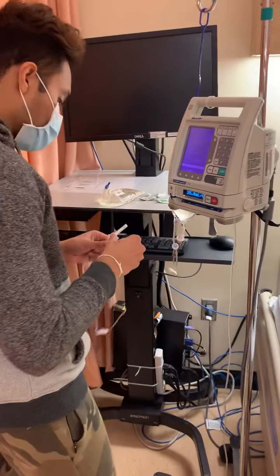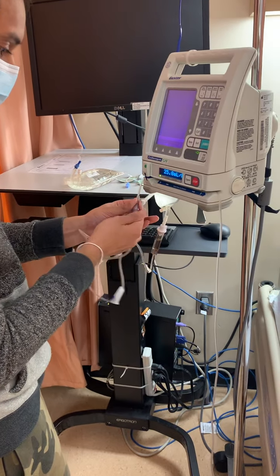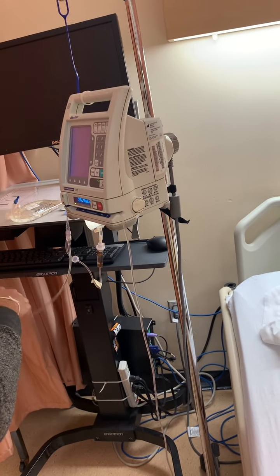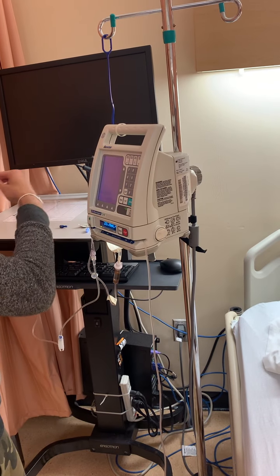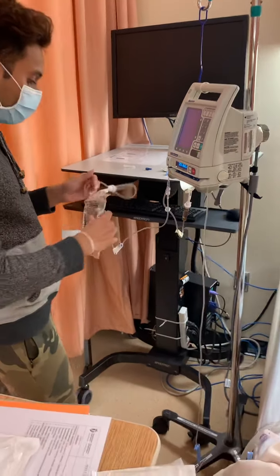We're gonna attach our port onto this using sterile technique. Okay. And making sure this is still clamped. Okay. And we're gonna attach our mini bag now, aseptically. So making sure we're using the sterile technique. Aseptically attach this. Okay. And we're gonna make sure to back prime.